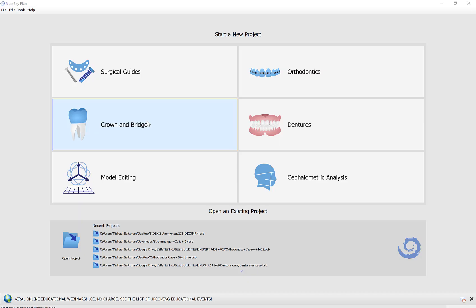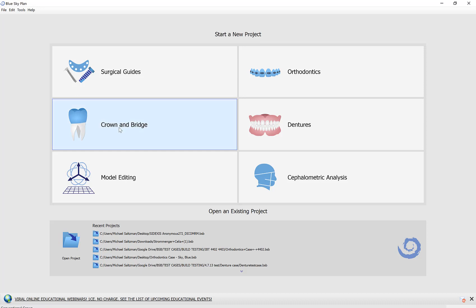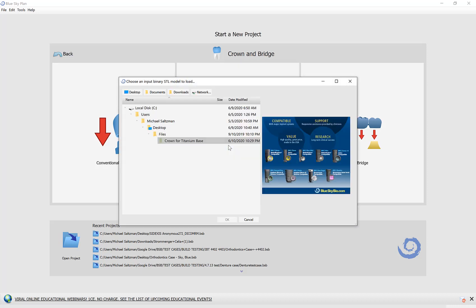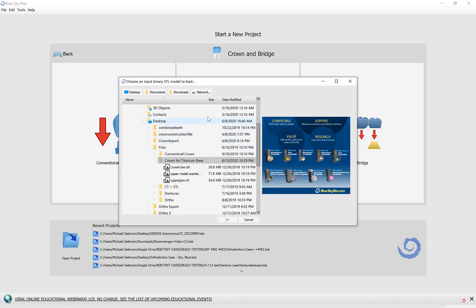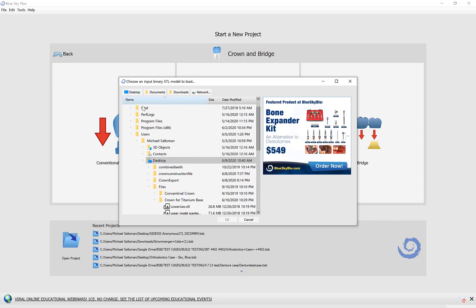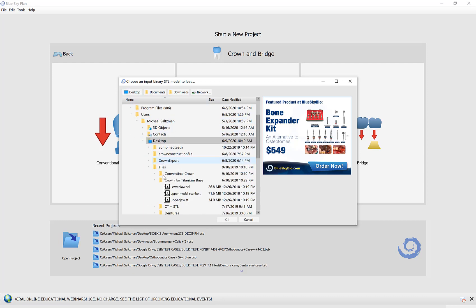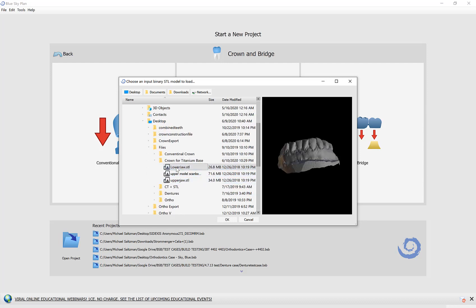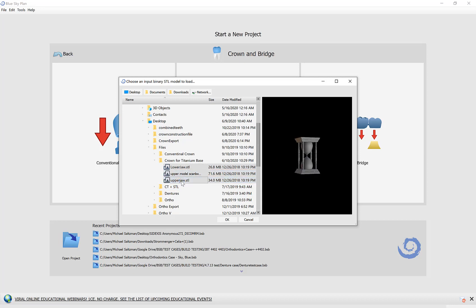Let's take a look at the process flow in the software. I'm going to start by clicking crown and bridge, crown for titanium base as that is what we are dealing with. I'm going to use the buttons that I have on the top here to navigate to my desktop and then select the files for this case. I'm going to left click on the first one, hold down the shift key and then left click on the other files to multi-select them.